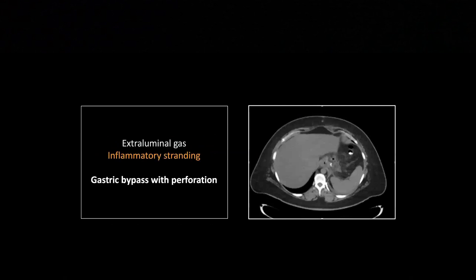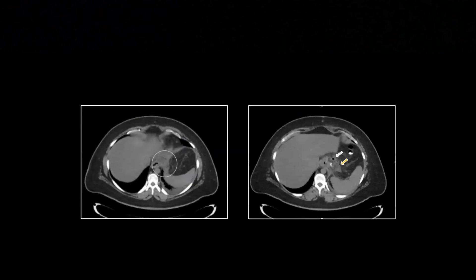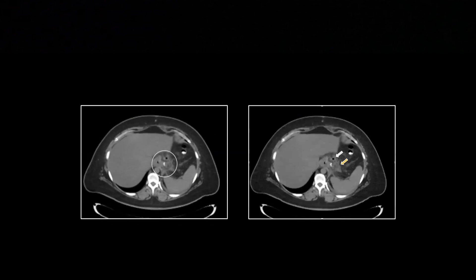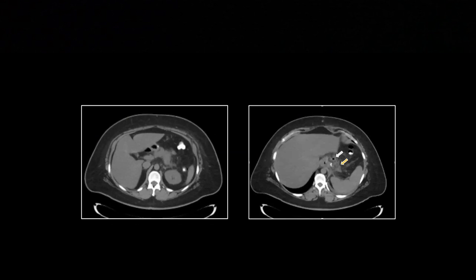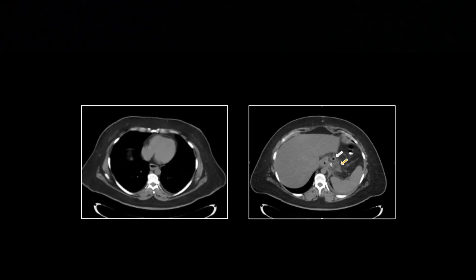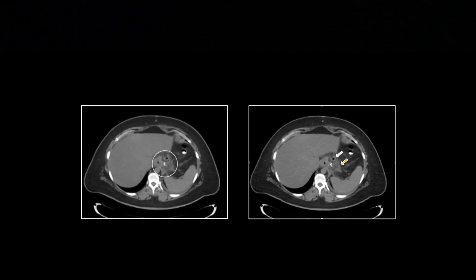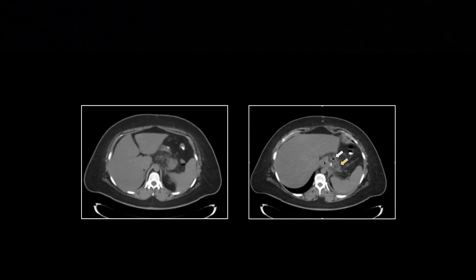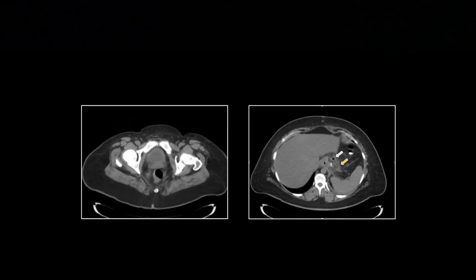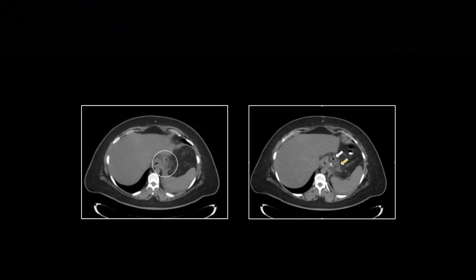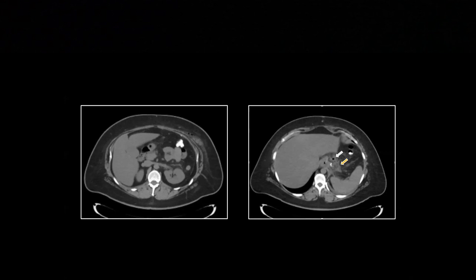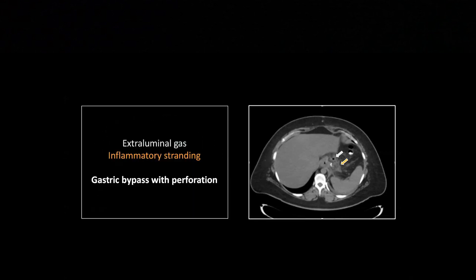On to perforations. This is a non-contrast scan, which is suboptimal, but you can see extra-luminal gas beyond the confines of the manipulated stomach with plenty of surrounding stranding — a straightforward case of gas outside the gastrointestinal tract. There is that staple line and efferent loop. This is probably an older case where they simply stapled the stomach without rerouting the small bowel.